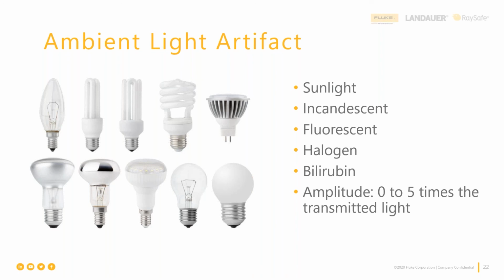So one of the things that even today anesthesiologists will do is, if they're measuring on the finger, they have the finger clip or the single patient use disposable pulse oximeter sensor on the finger, they will take the package that came out of and put it over the top of that sensor to do what? To block out sunlight, block out fluorescent light, anything that has this flicker or would provide an inappropriate or artifact signal that would confuse the pulse oximeter in order to clinically get the right reading.